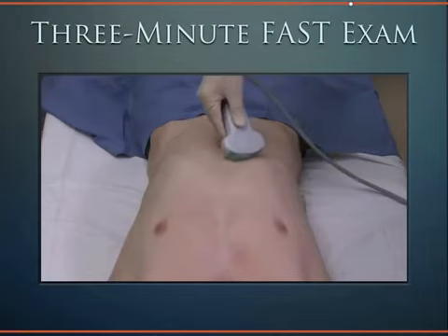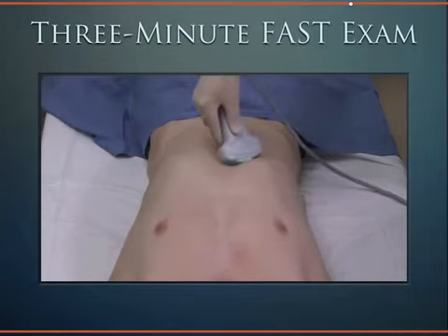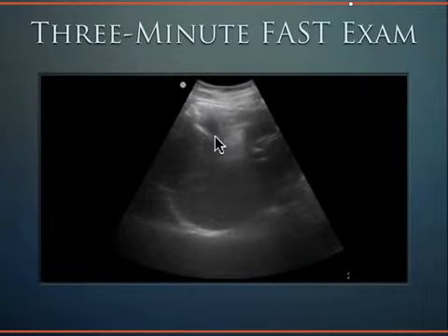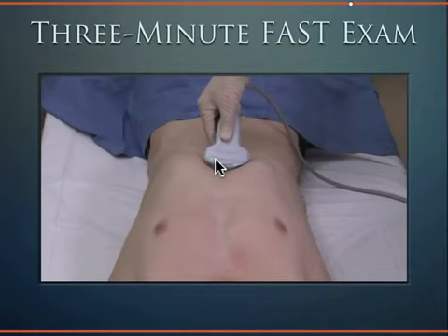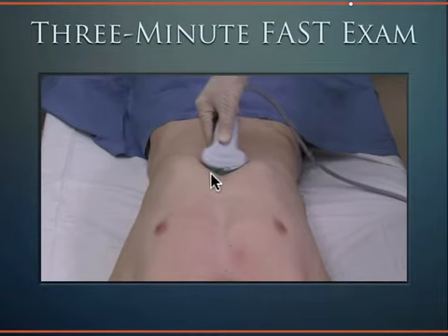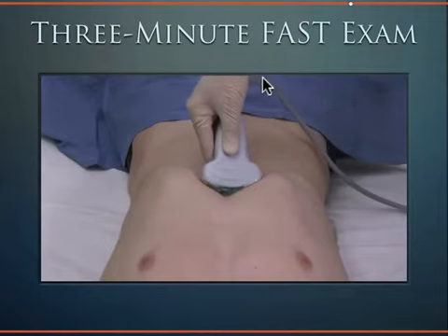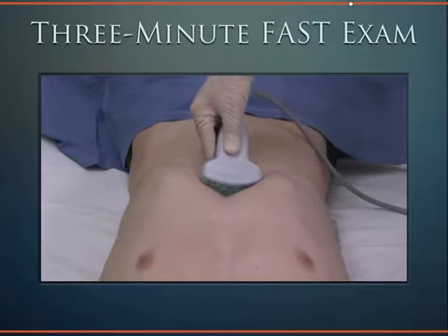The next window of the FAST exam is the subxiphoid view of the heart. Start at the liver and then use the liver as the window to visualize the heart. Start here at the liver and then slide all the way up into the subxiphoid notch. Ensure that the indicator is towards the patient's right and the cable exits the bottom of your hand.